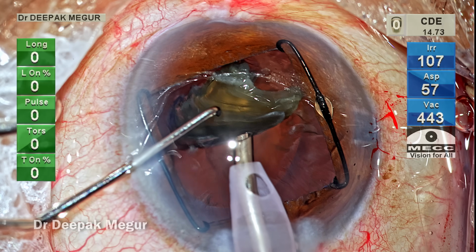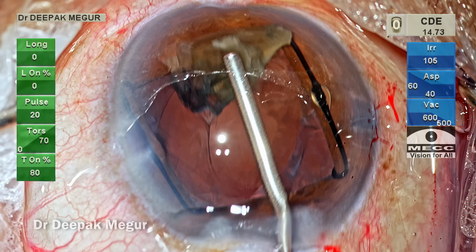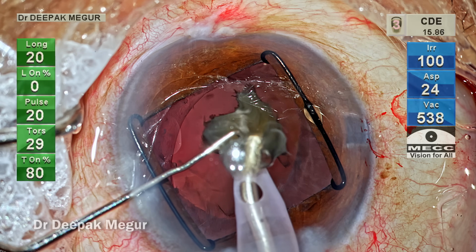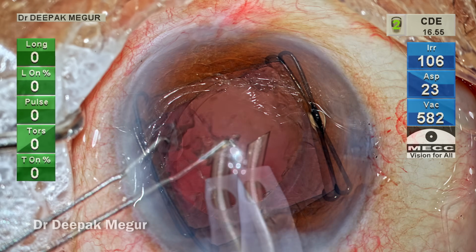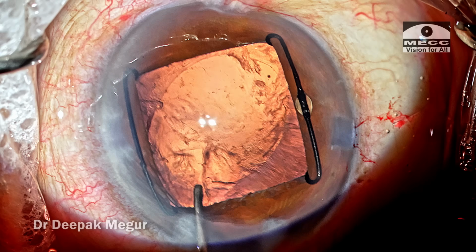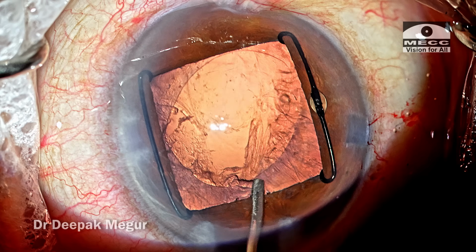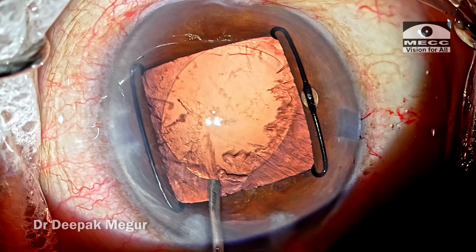Now, before emulsifying the last fragment, I'm going to refill the chamber with OVD, and then the last fragment is emulsified. So now is the time to remove the cortex. We need to remember that in eyes having generalized zonular weakness, the cortex aspiration can be tricky.